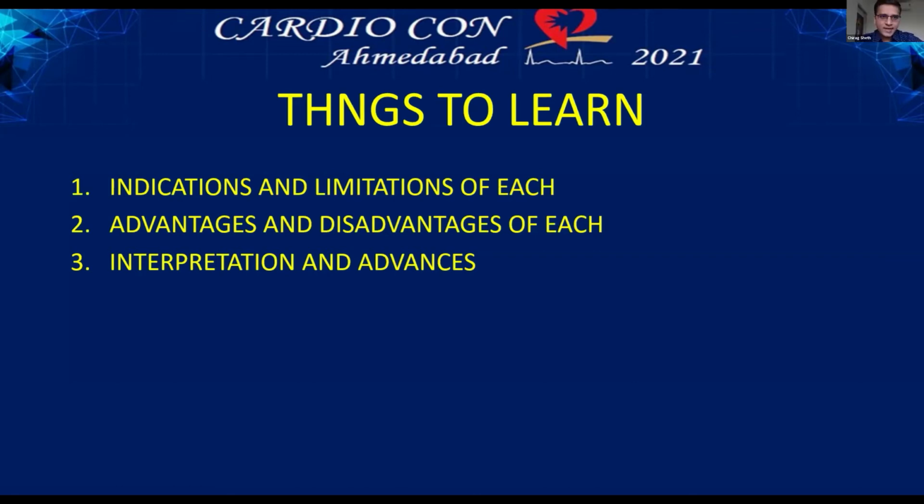Let me tell you, the last slide of my talk was that, over the advancements that we have witnessed in OCT and IVUS, whichever modality you are comfortable with, it is okay to use. Whether you are comfortable with OCT or IVUS, use some imaging compared to no imaging when you encounter stent failure. The only thing IVUS would probably give better would be the extent of plaque burden and the sizing of the vessel.